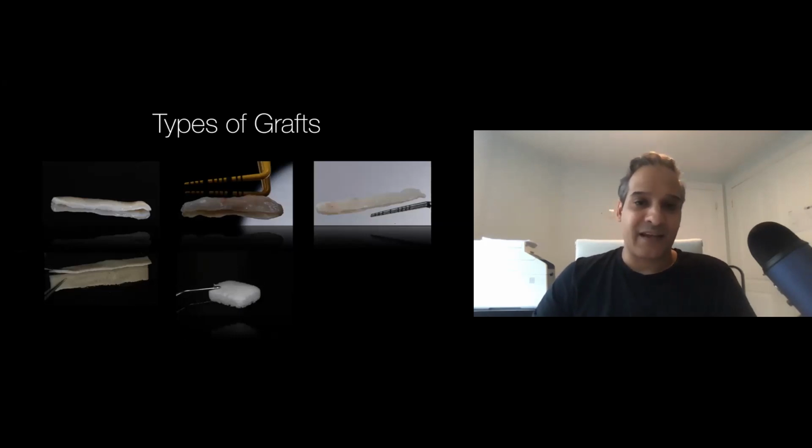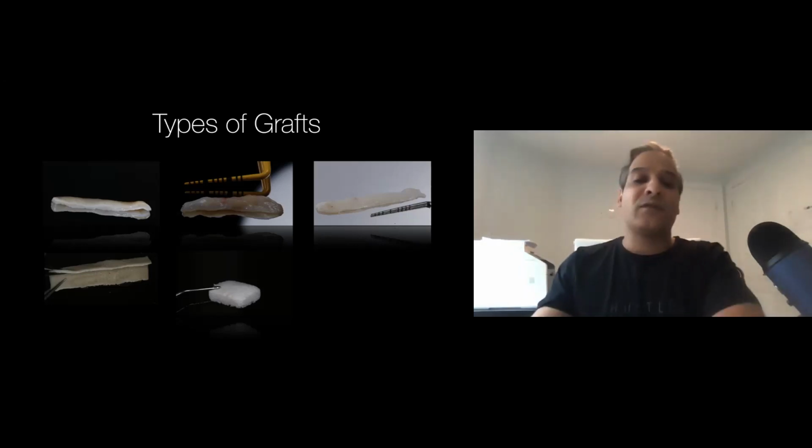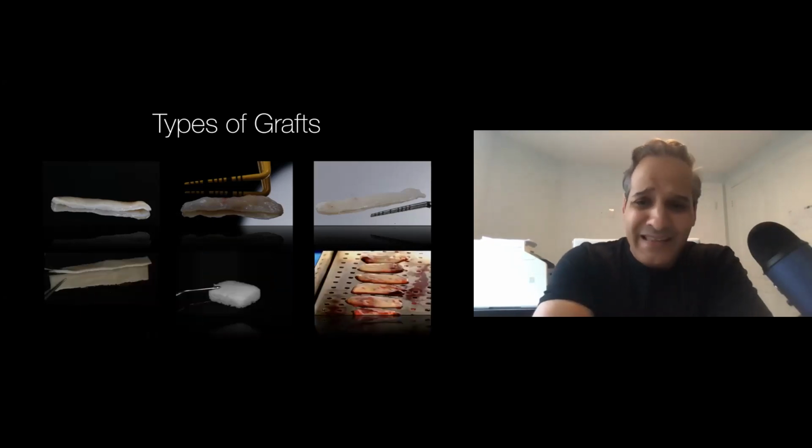It acts like a scaffold where cells can grow into the site and then slowly turn it over into tissue. The pinhole procedure itself is based on this, where they use collagen membranes to stuff and tent the site, and the goal is that soft tissue will penetrate and turn the collagen membranes into connective tissue. And now we also see some cases where you can use PRF membranes as a graft material.